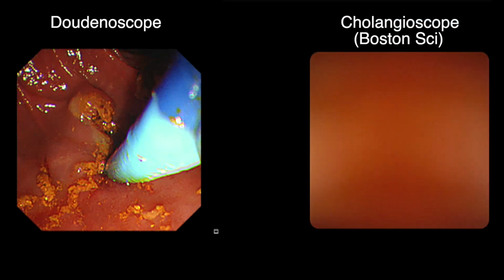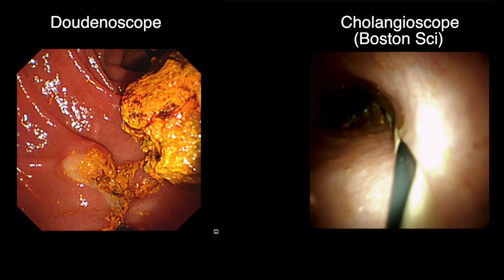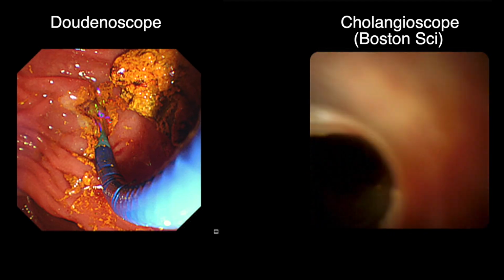A final check with the cholangioscope shows clear bile ducts with no large stone fragments remaining.